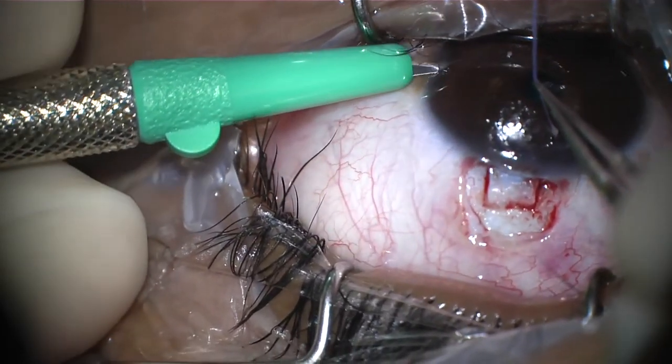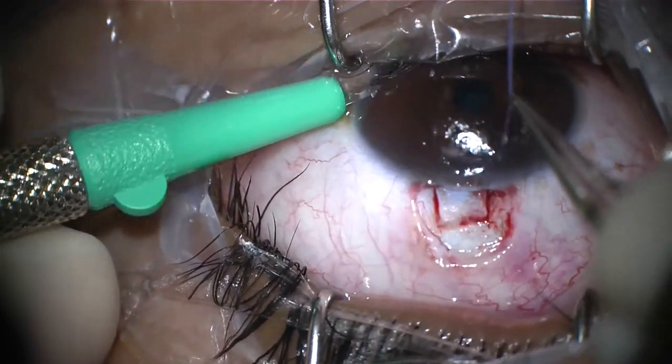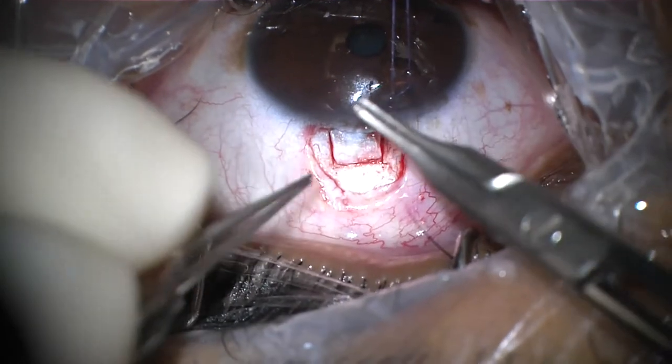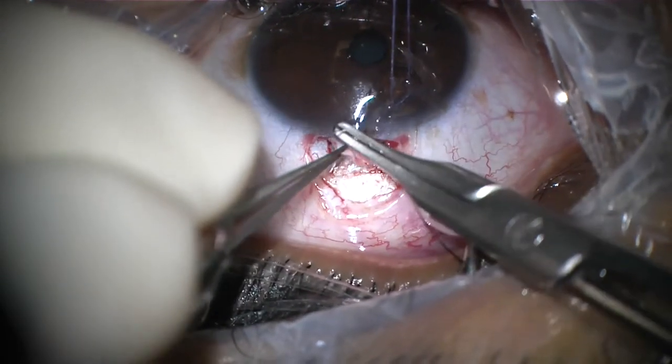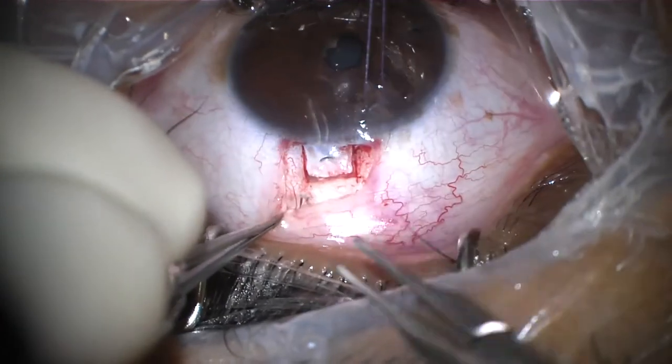Making a paracentesis at the temporal side. Then placing a 10-0 nylon suture for two releasable sutures at the scleral flap.